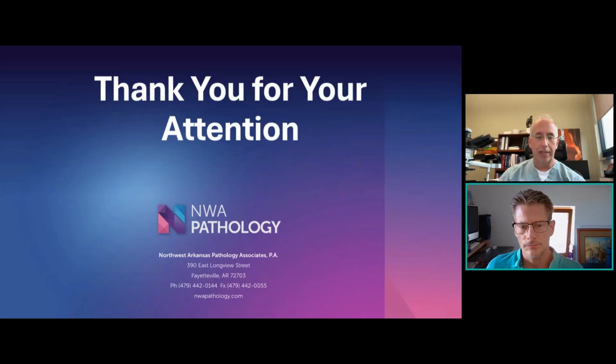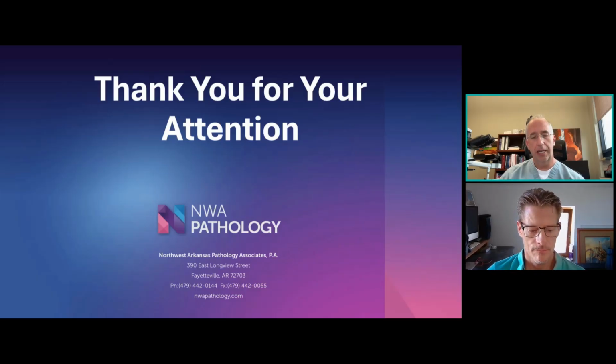Great question, Mark. I can just tell you our empiric experience. And so 1 scanner can support about 1.5 pathologists. And so we can do about 3 pathologists worth of work each day with 2 scanners.